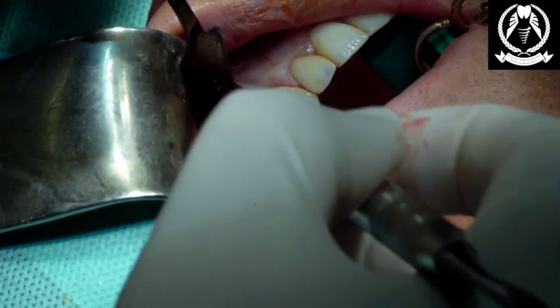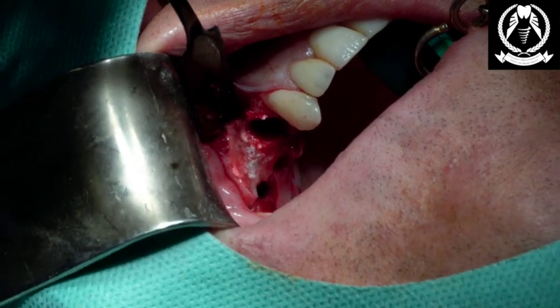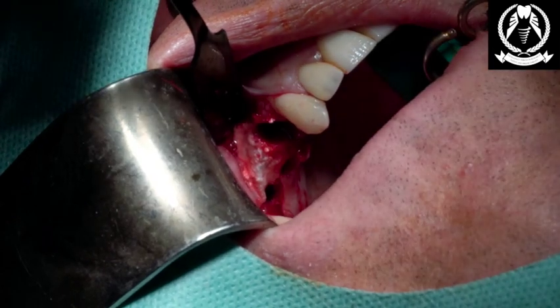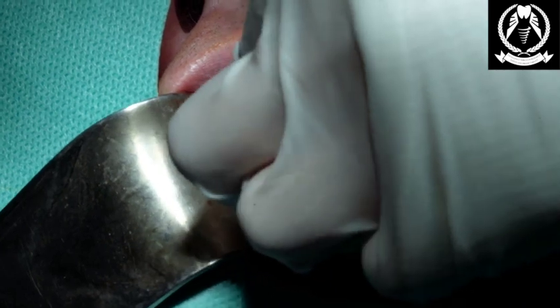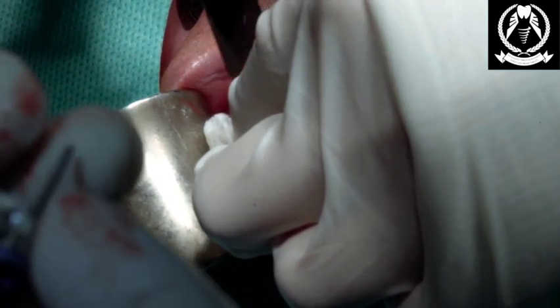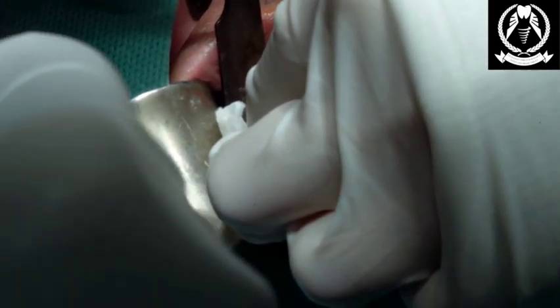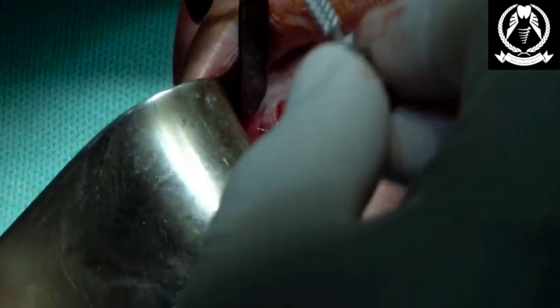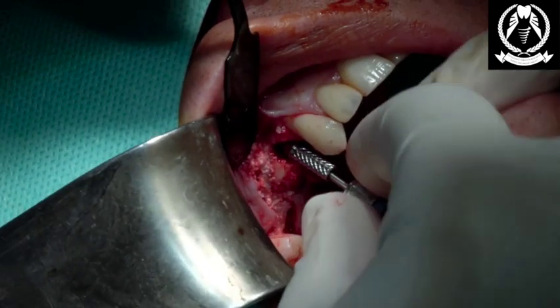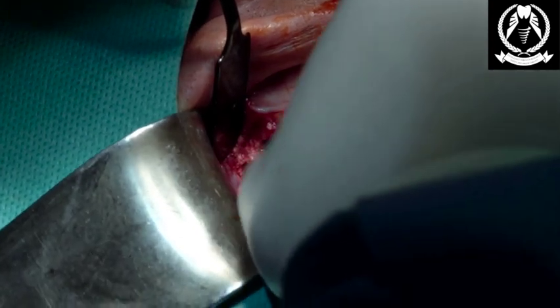Well, you want to give me the temporary abutments directly. Whatever you want to do. Give me the temporary abutment. The titanium temporary abutment, yep. I'm going to do that. So a couple of temps on. And we can directly scan this using the Trios system to make our bridge in a month. Okay, Alan, you good? Awesome. Open wide, sir. Move your right hand down a bit, Avik. Sorry. That's it. Just trying to block that in.